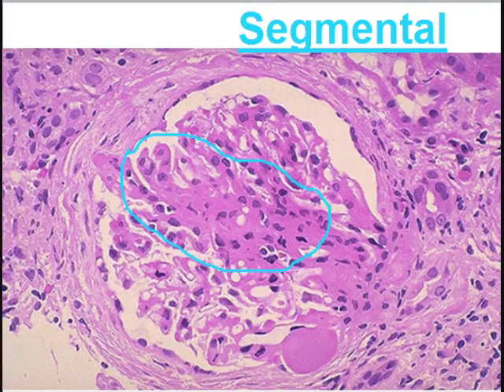Under the microscope, the renal biopsy showed involvement of only few glomeruli by the disease process. High power showed segmental involvement — only a portion of the glomerulus is involved.